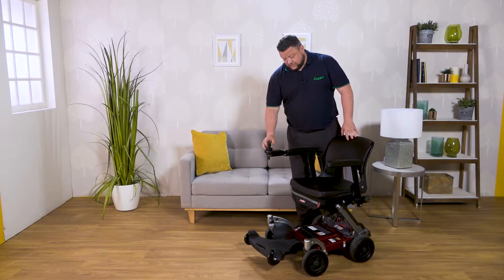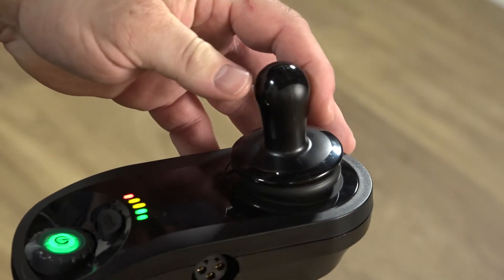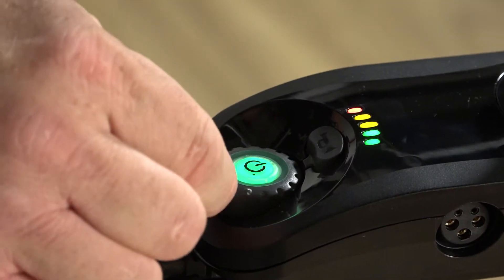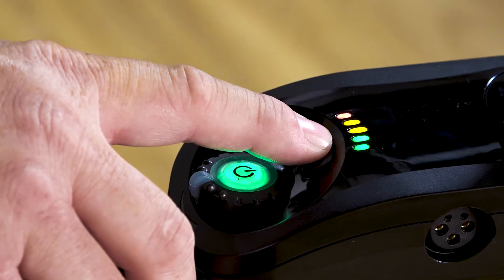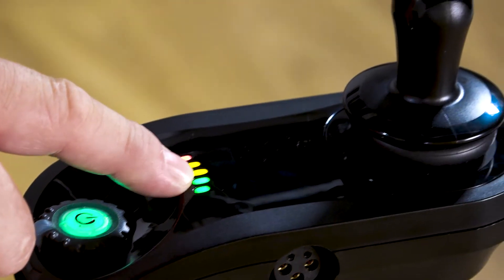The control unit is very straightforward. The joystick takes us forward, back, to your left, and to your right. There's a speed control dial that allows you to go from two miles an hour up to a maximum of four. You also have a horn, and there's a battery power display as well.